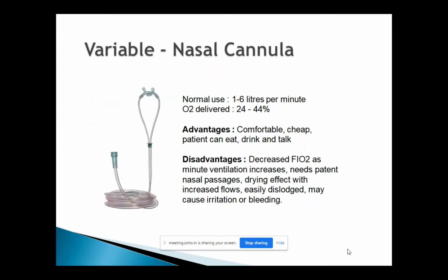Okay, so with nasal cannula, I haven't seen many mistakes happen. A couple of times I have come across patients put on more than 6 liters of oxygen via nasal cannula because they don't like masks, because they're claustrophobic, but their oxygen demand is high. For example, they might have tried them on 6 liters of oxygen, but their saturation was still very, very low, not at an acceptable level. So then somebody would have gone and put the oxygen up to 8 liters or 10 liters. That is not the right practice.